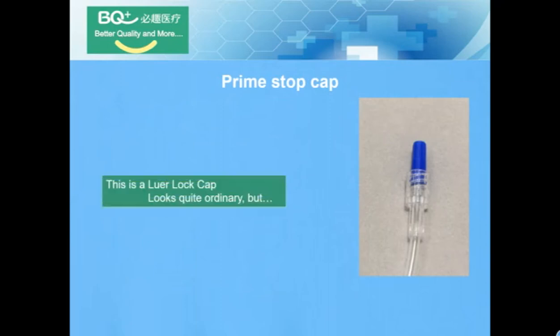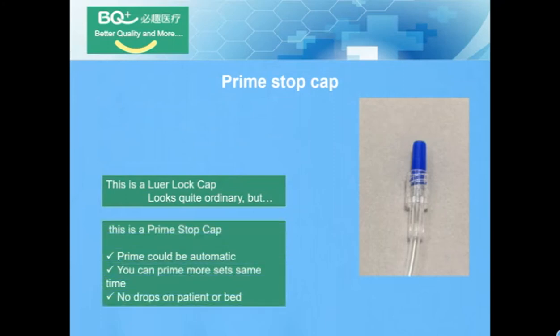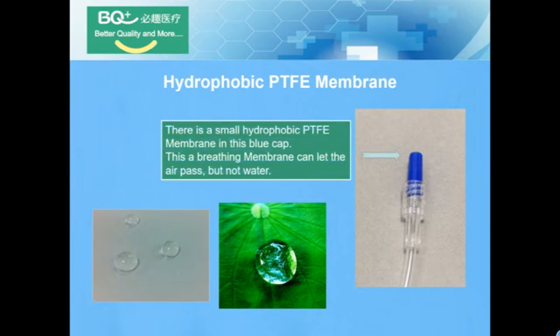Prime Stop Cap. This is a Luer lock cap. It looks quite ordinary, but this is a prime stop cap. Priming can be automatic — you can prime more sets at the same time, with no drops or mess. The membrane is the secret. There is a small hydrophobic PTFE membrane in this blue cap.